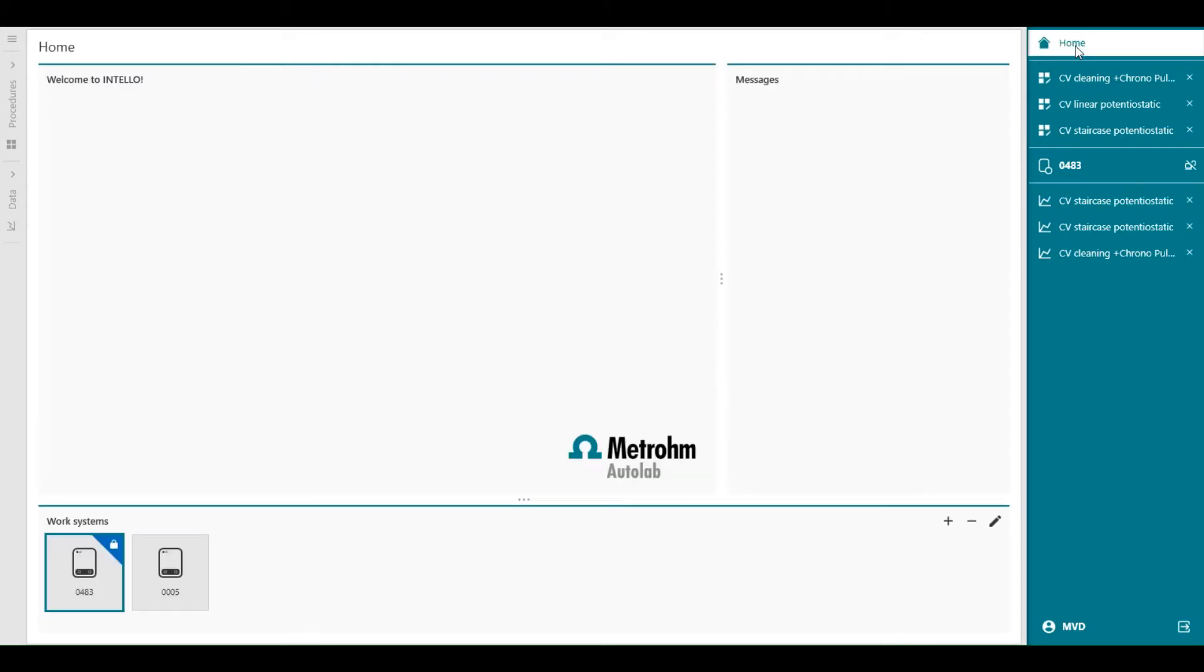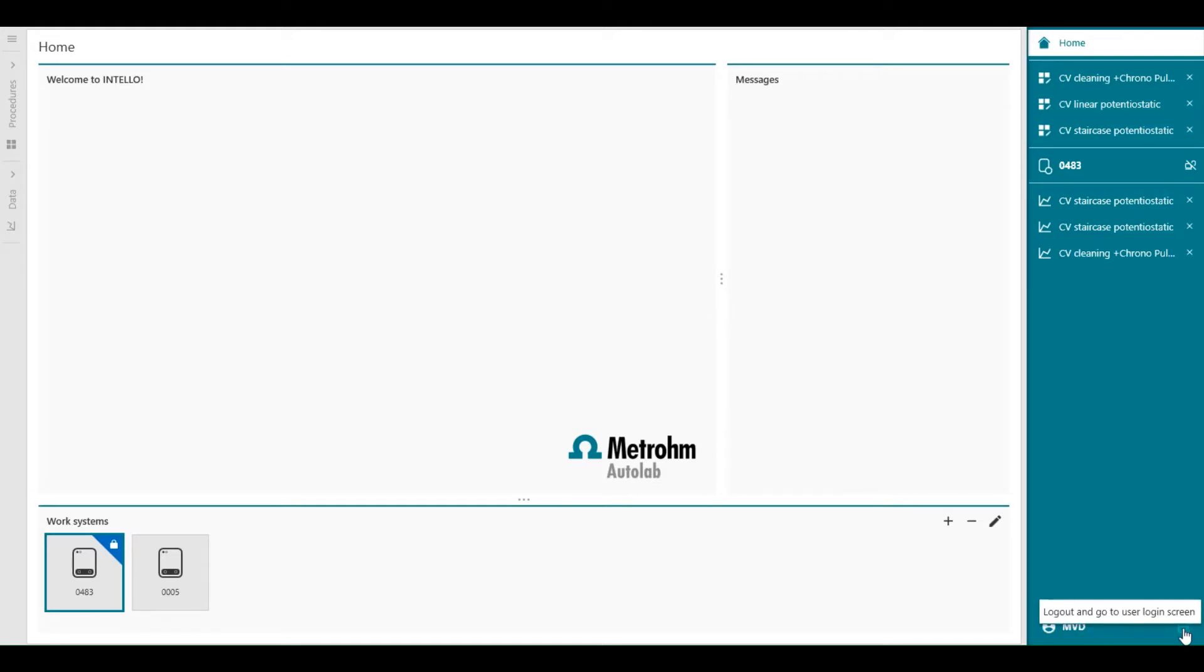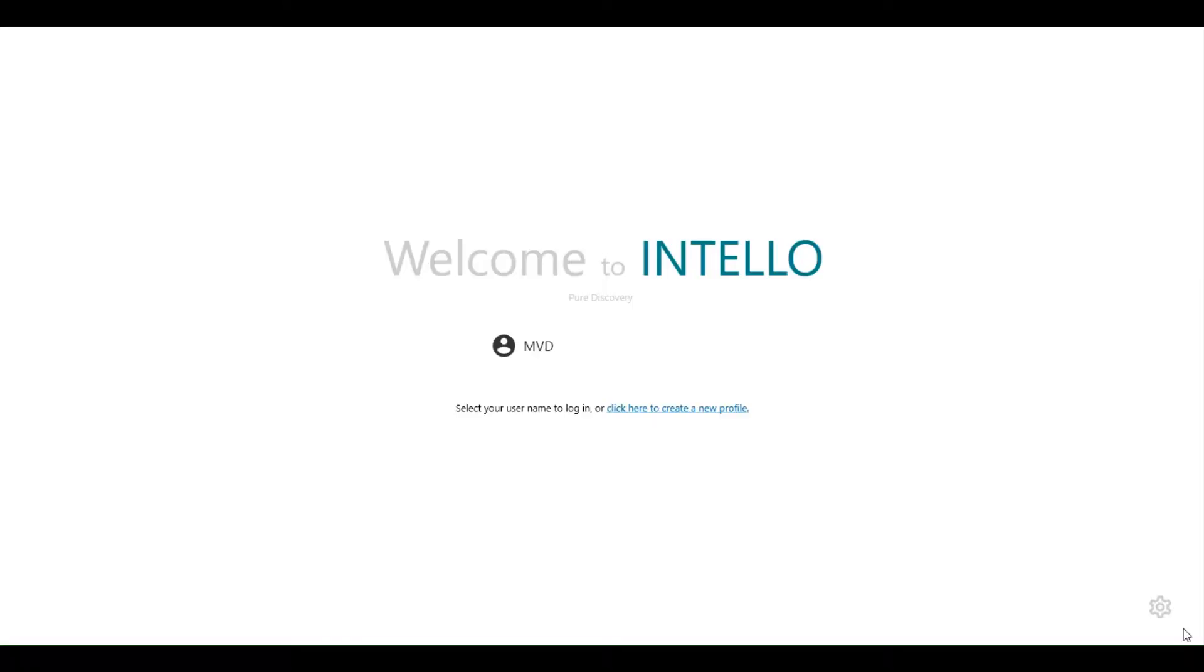At the bottom, the name of the user currently logged in is visible, as well as the icon to log out and change the user. So we can see here, log out and change a user.